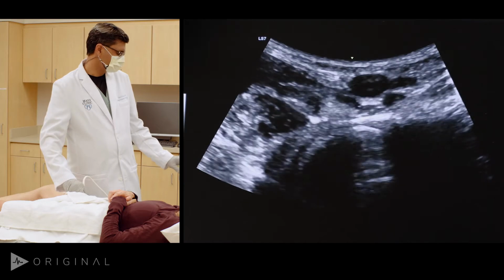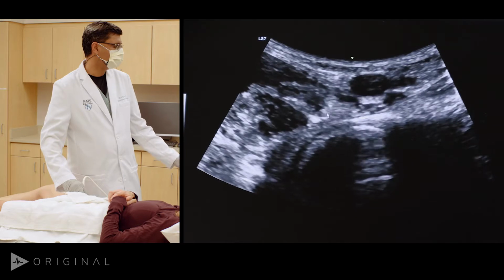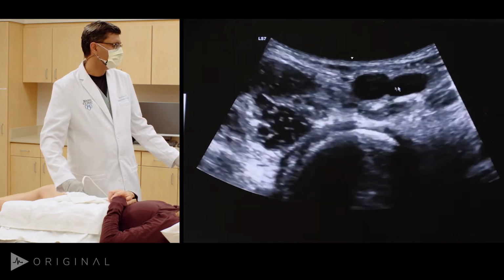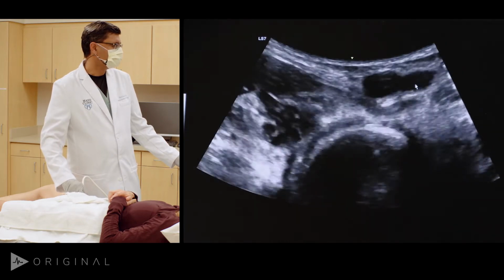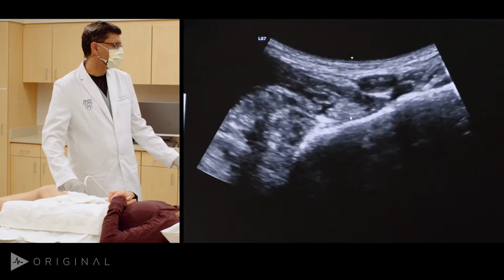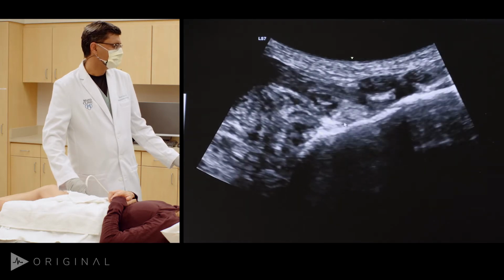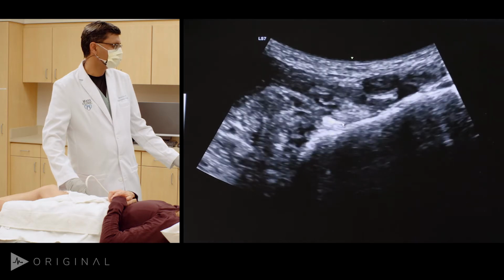This is the transverse view of the psoas tendon. You can see here the tendon is really hyperechoic, right anterior to the acetabular ridge. And you can see that when I compress here, that's the vein. So we have the femoral vein, the femoral artery, and then the iliopsoas tendon right here, anterior to the acetabulum. Right behind this is the bursal space. That's usually a great place if you have to do an iliopsoas bursal injection.